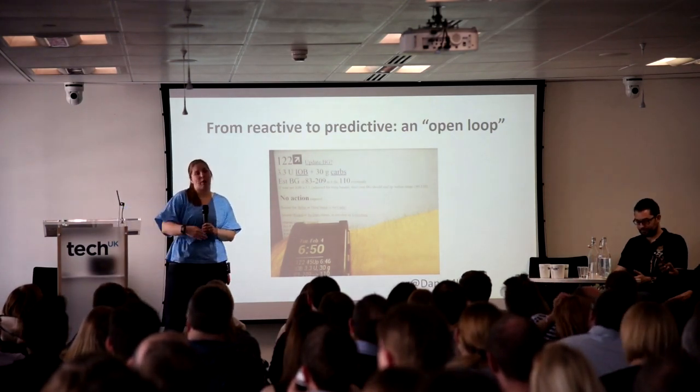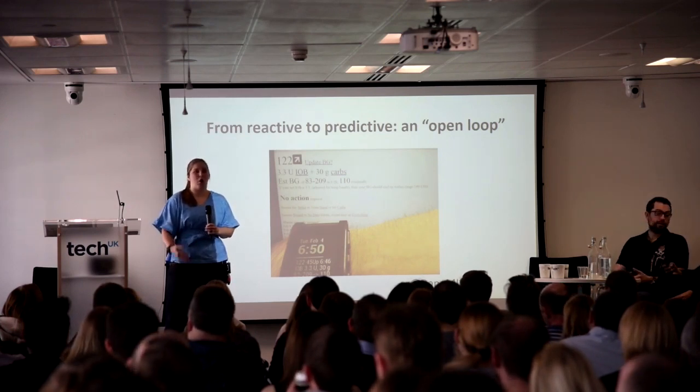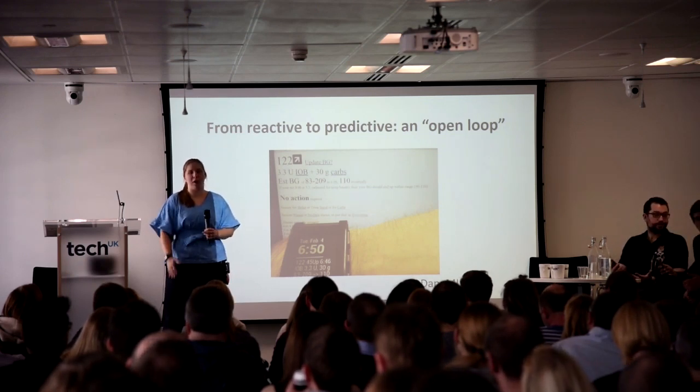If you do something now, you won't have to be distracted later from what you want. And this was so amazing. And I used this open loop system. Didn't realize it was an open loop. I just thought it was smart alarms, predictive alarms, this great algorithm.